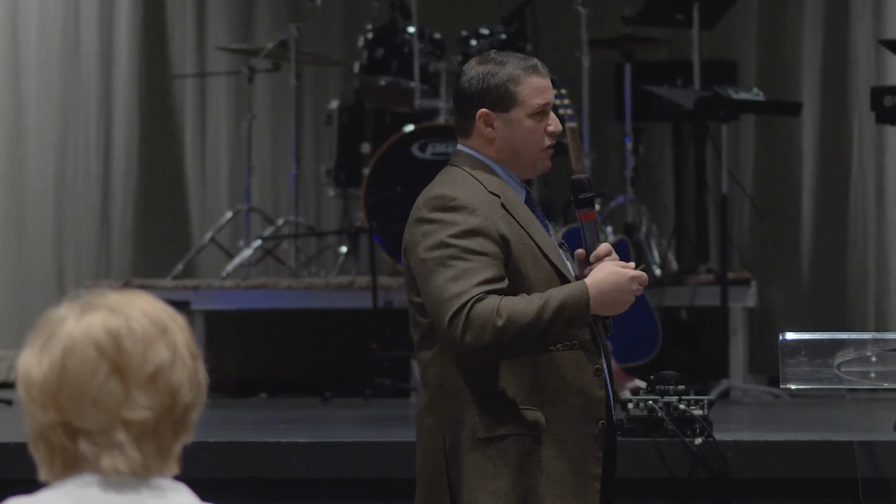Fluoroscopy is an x-ray machine. So we bring the x-ray machine right in and look at your hip because of the special table. So we should be able to get the leg lengths nearly exact to the millimeter, and the offset, meaning from the pelvis to the outside of the hip, nearly exact to the millimeter as well, because we're doing it looking at the hip and with x-ray. Whereas the anterior lateral or posterior, we're just doing it from clinical. We're looking at it and getting it as close as we can.